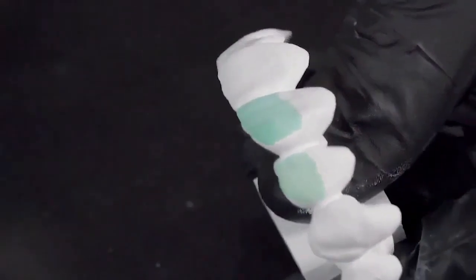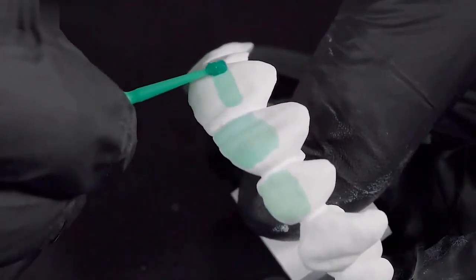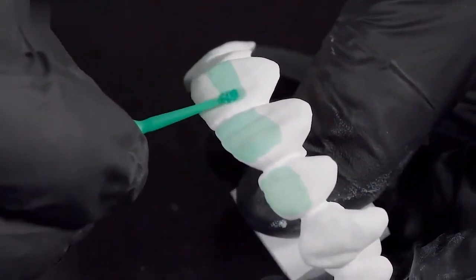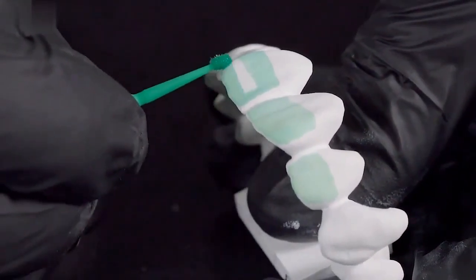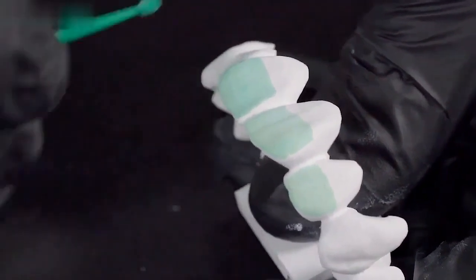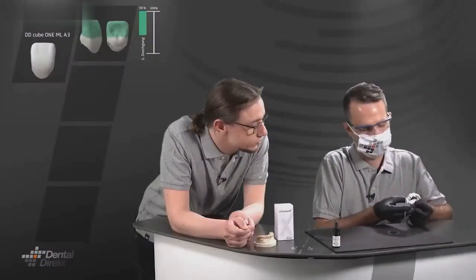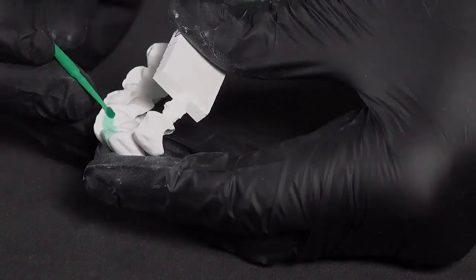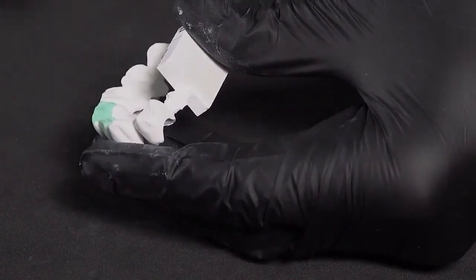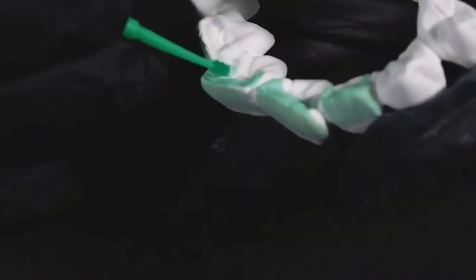It's easy to forget here, and of course we particularly need the translucency, that's where we want it. If you think of the natural tooth, that's where it's really translucent. Exactly, you can of course vary that in practice, depending on the situation. Here we have relatively large front teeth in this case. And then I go from outside, then buccal, and of course now palatal again. It's a bit tricky, because of the anatomy and morphology, but you can still apply it very nicely and very quickly and easily with the applicator.